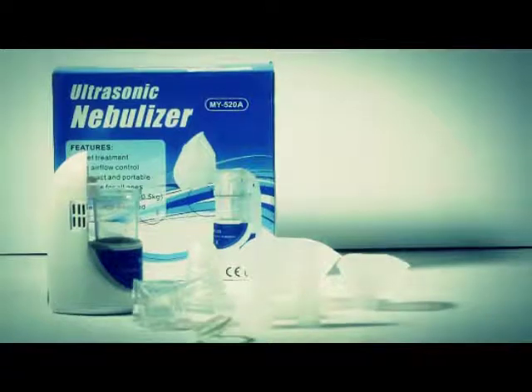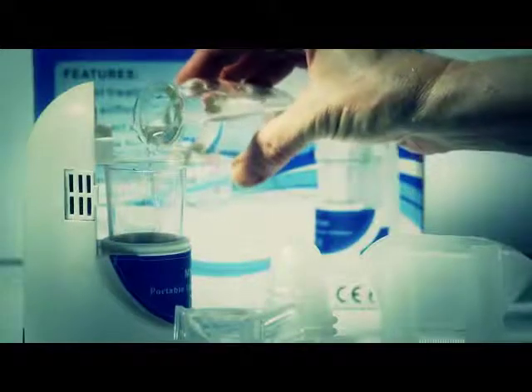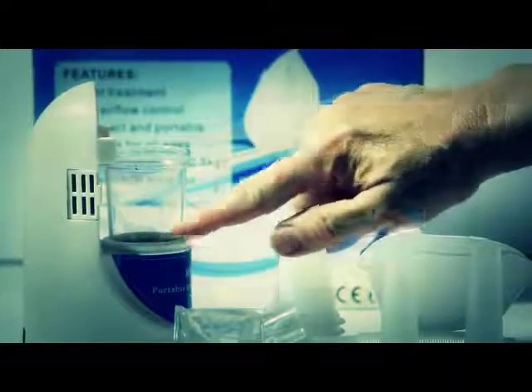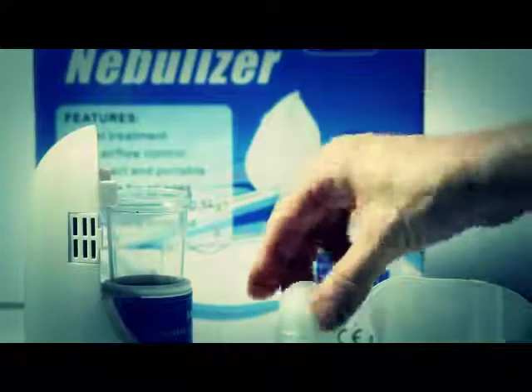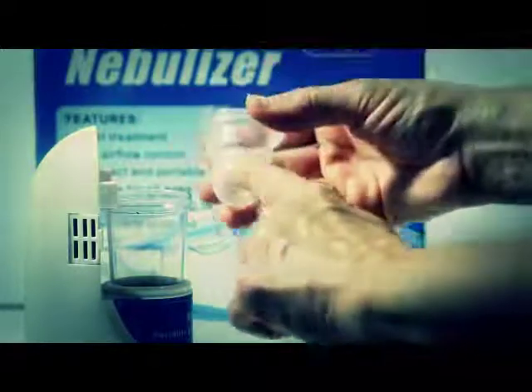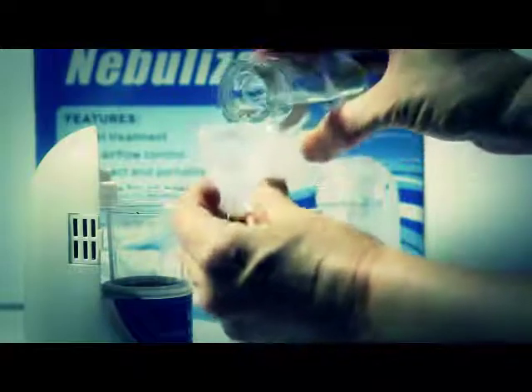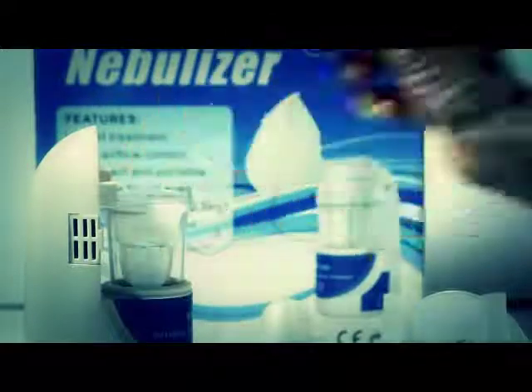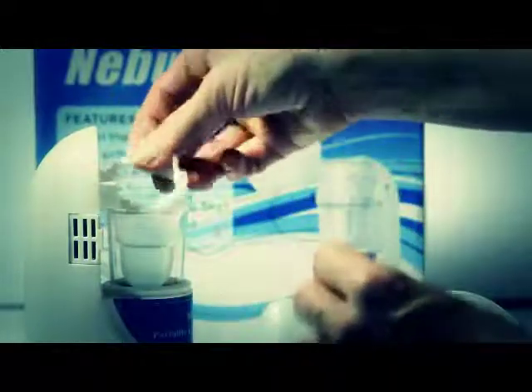To get it set up, you need to fill the basin up to the latex ring with distilled water. Please note that the unit will not function if you do not add the water here. Next, take one of the plastic medicine cups and add whatever medication, saline solution, or whatever has been prescribed by your physician. There is an indentation on the cup that indicates the maximum amount you can fill to. Then drop the plastic cup into the unit and place the plastic gasket on top of the cup. It only fits one way, and this will create a seal over your medicine cup.